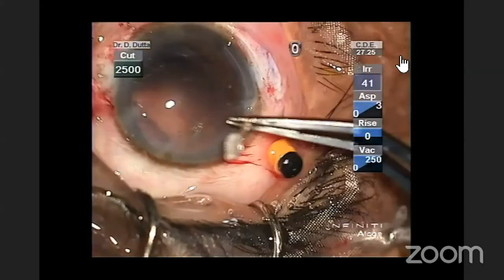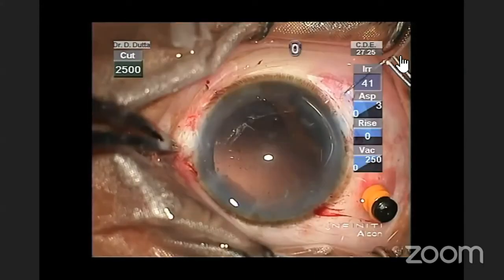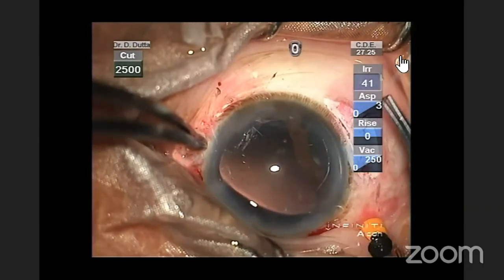Now we are going to use the Gore-Tex suture as you are pretty young. I told you that it is off label.